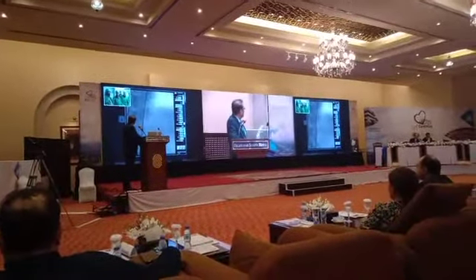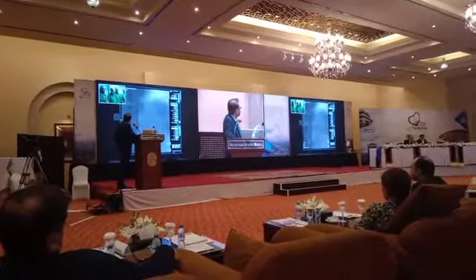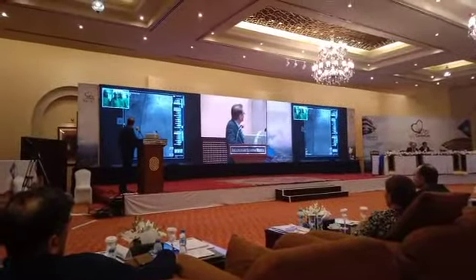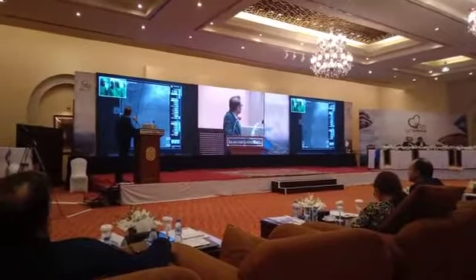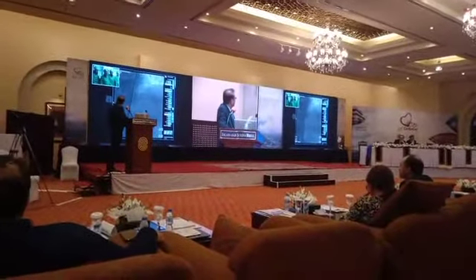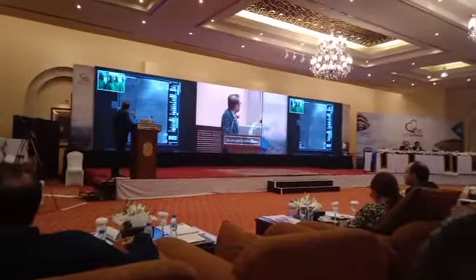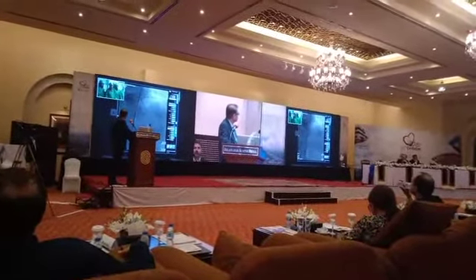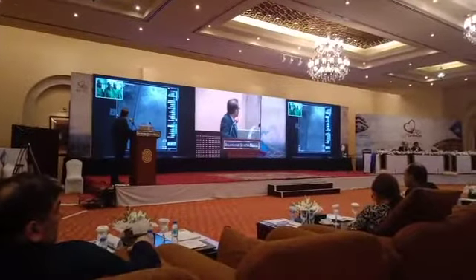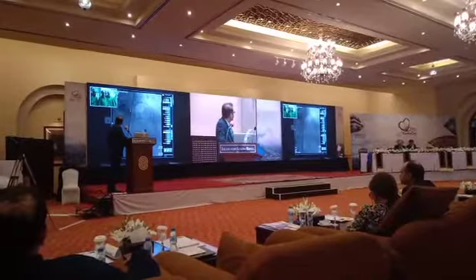So can you just let that angiogram run, please? Just next picture. So we've got a 7 French guide in place. It's slightly short, as you can see. This is a 3.0 guide, but we've been able to wire the LAD. This is a run-through wire that we put down here, and that's the first angiogram picture. So you can see that there is diffuse in-stent restenosis in these drug-eluting stents.